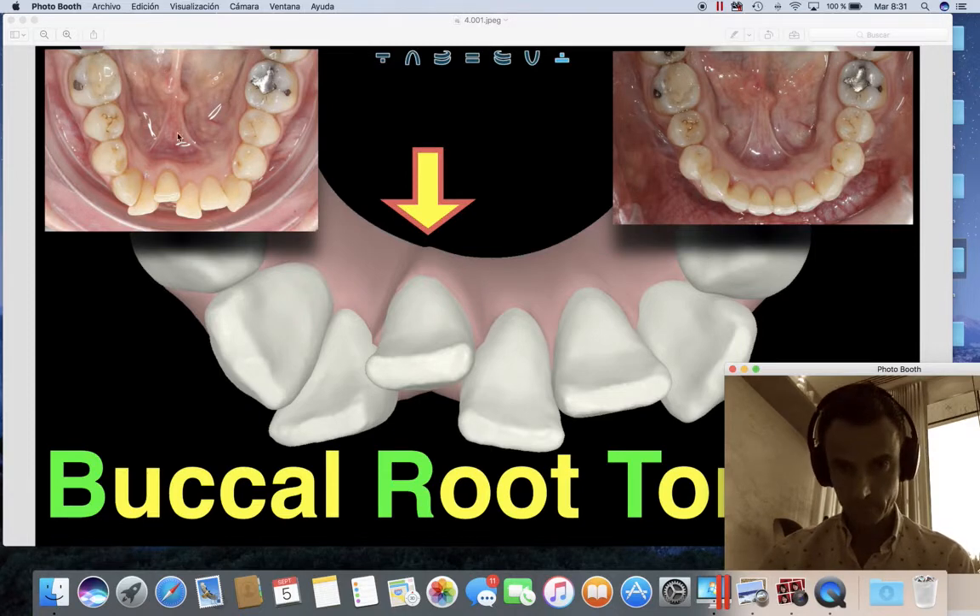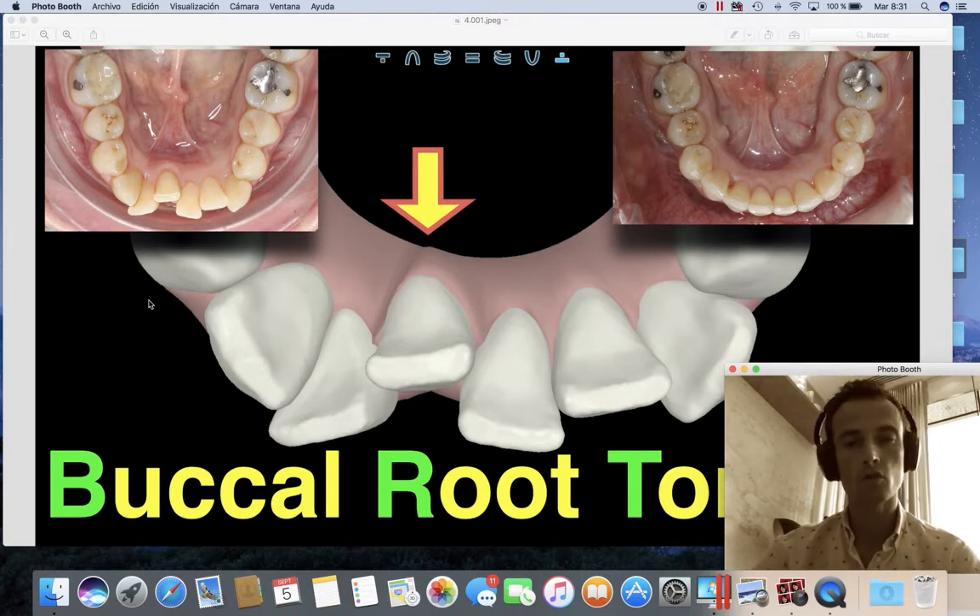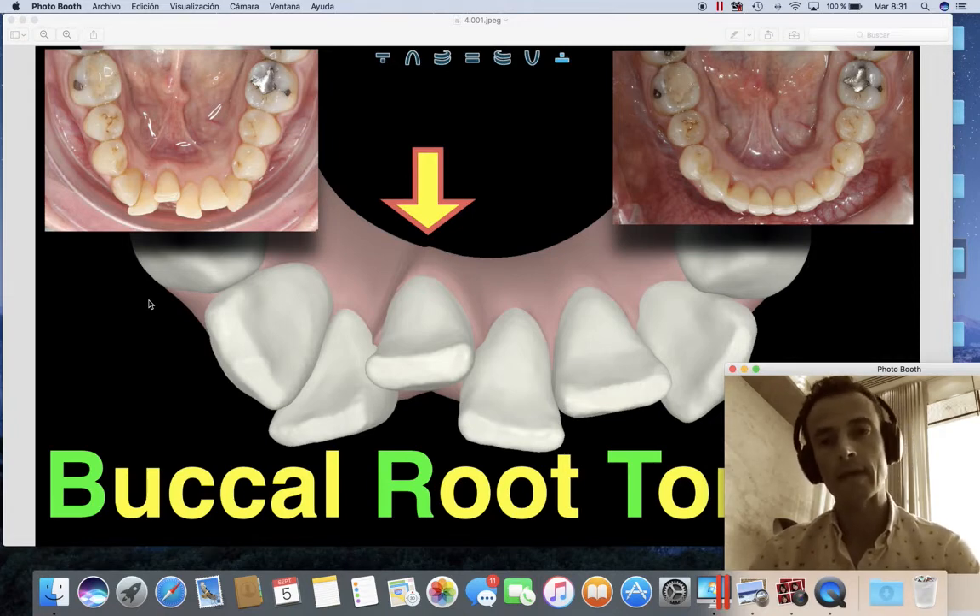So if we compare — look at this picture on the left — we have a lot of crowding and an asymmetric shape of the arch. We have one of the central incisors, the lower left central incisor, totally blocked lingually. Look at where the root is — we can also see the volume on the lingual side. So we want to procline that.